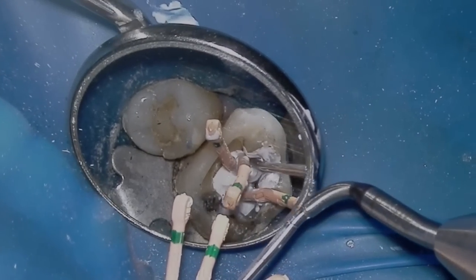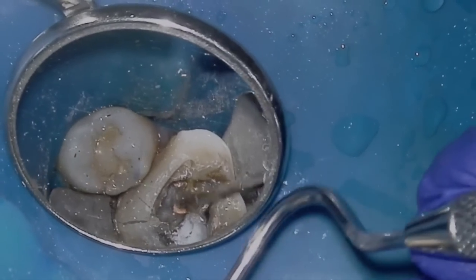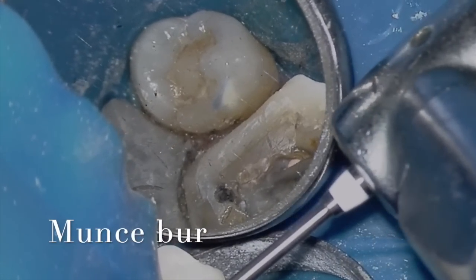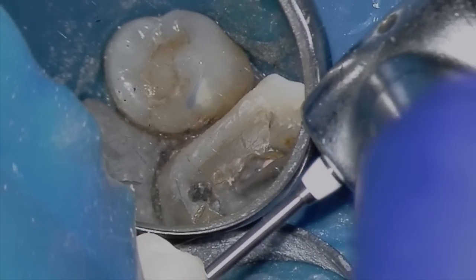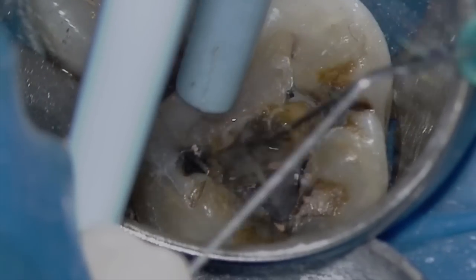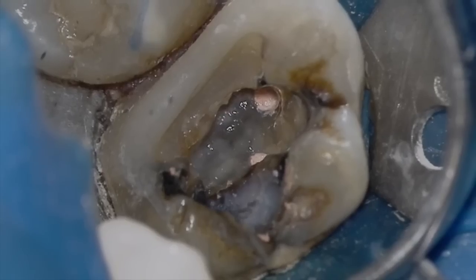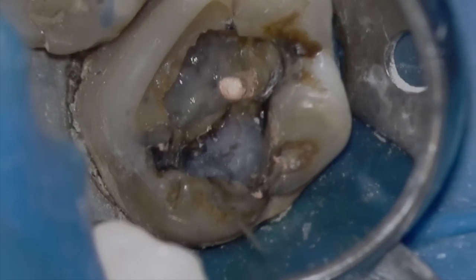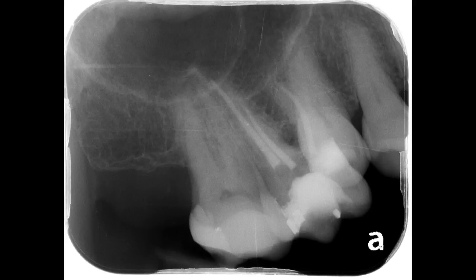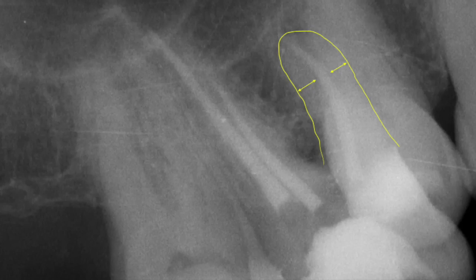With the cones placed and happy with the radiograph, we're going to sear off the tops of the GuttaCore points, but I'm still not happy about not finding MB2. I'm very lightly troughing with the Munce Discovery Bur now and using sodium hypochlorite to change the color of the pulpal floor — I can see the pulpal floor. I'll say that likely MB2 is either not there or I just can't get into it. We place a cotton pellet and then cavit. Taking a shift shot looking at the mesial buccal root, the GuttaCore is centered — so likely no MB2.